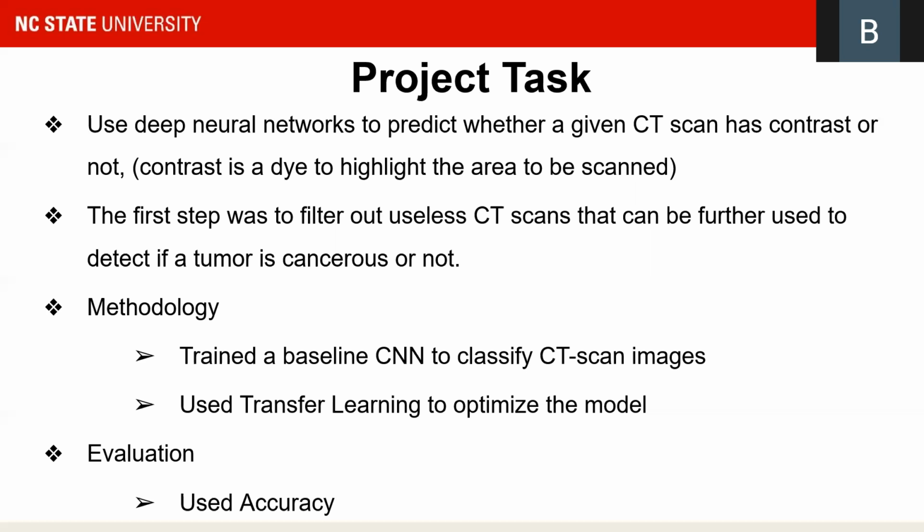The methodology we followed is that we trained a baseline convolutional neural network to classify CT scan images, and then we used transfer learning to optimize the model. We evaluated it using accuracy.